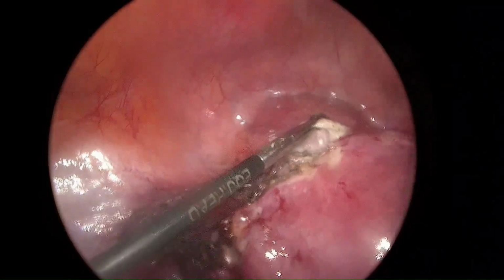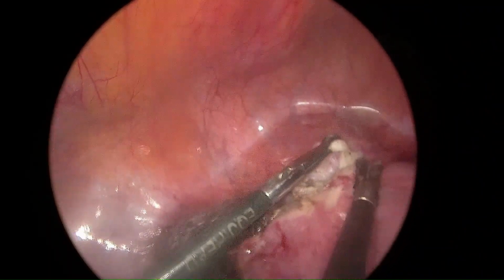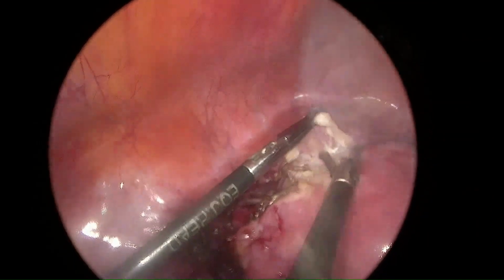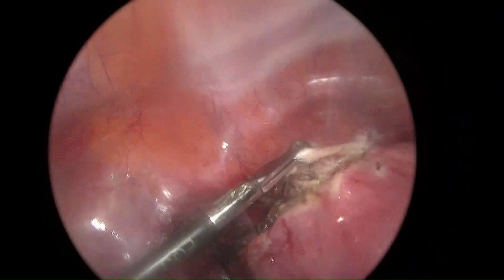After the medial umbilical ligament is reached, the peritoneum is lifted up by inserting one of the prongs of the bipolar shearer. It's coagulated and is cut only with the tips. This process is repeated from one end to the other.